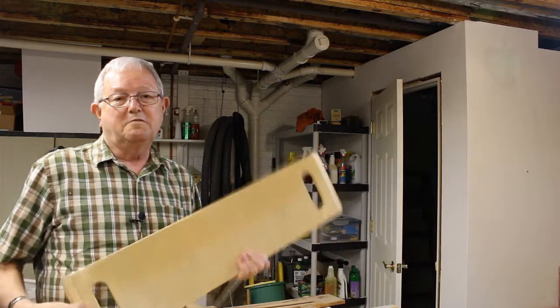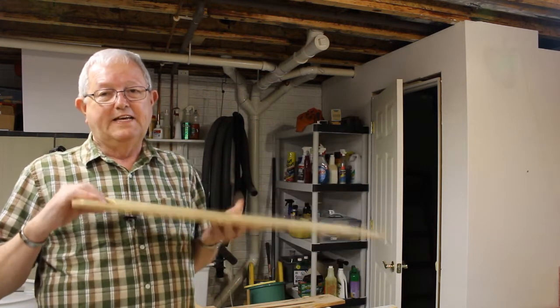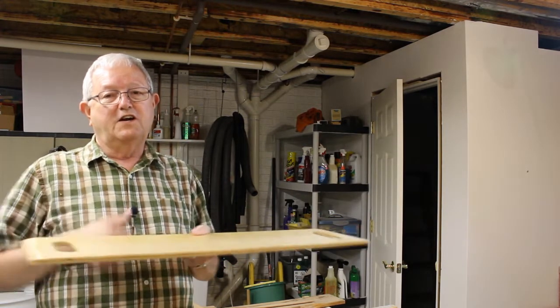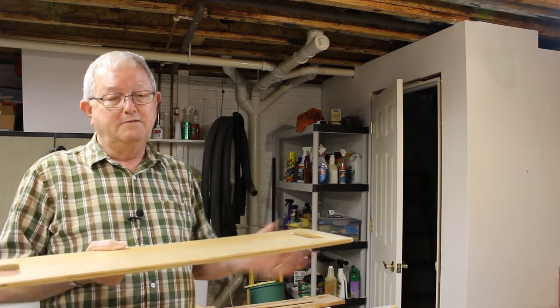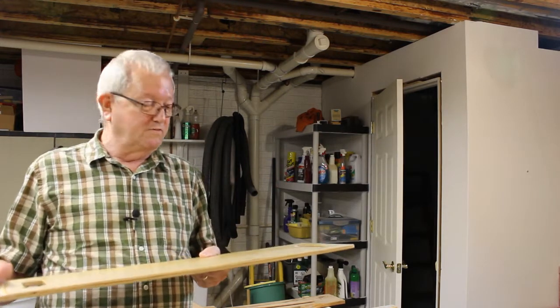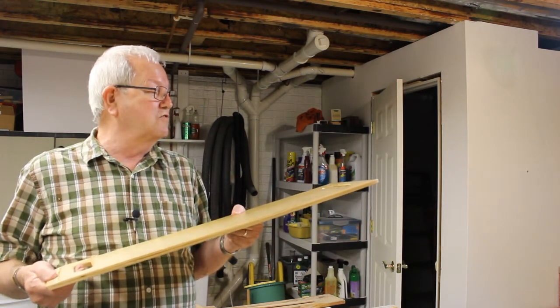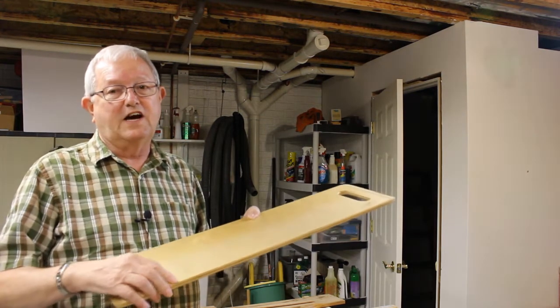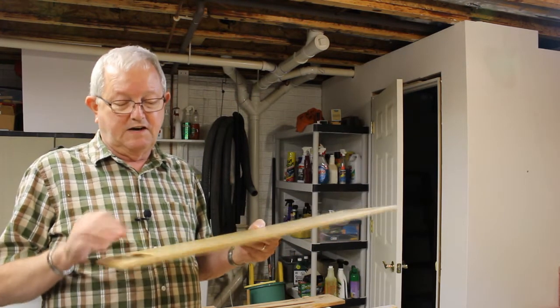Temporarily my daughter is confined to a wheelchair. This board is called a transfer board. It sits on the edge of the wheelchair, on the edge of a car seat or a chair or a porta potty, and it enables her to slide across from one thing to another. This board is 30 inches long. She feels it's too long — they make a smaller one, but they didn't have it in stock. So she asked me if I could cut about five or six inches off of it and then cut a new handle.